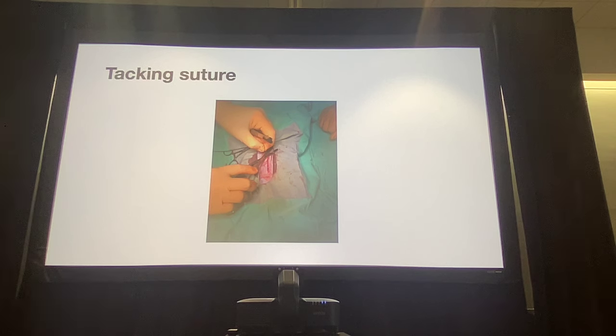But it's a long surgery. You're going through the entire tract, and that same loop thing, times ten. You have to make sure you're not making a loop that's too big, because then organs can herniate through. But you don't want it too tight, or it'll cause a blockage.